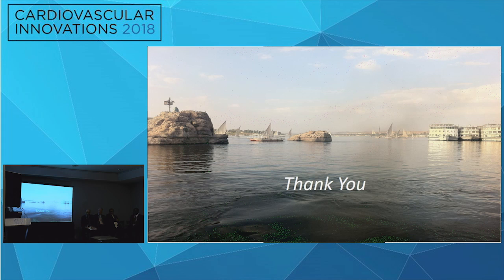Spectacular case, very difficult, and a lot of good technical wizardry there that managed to get you through. I think you always have to be a little sanguine about the radiation exposure at the time of the case. You did a nice job with containing the contrast volume. That could easily have been a 400 or 500 cc case. But 4 grays or more, you have to really be mindful about that.